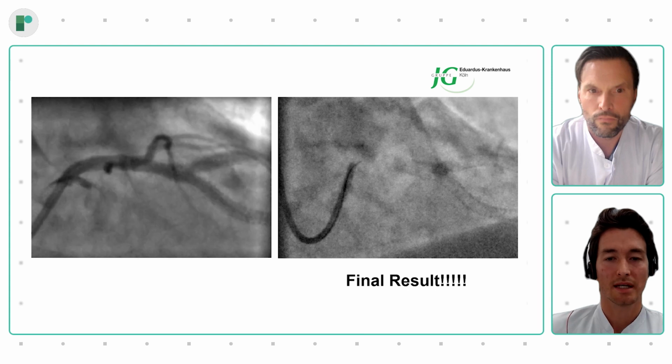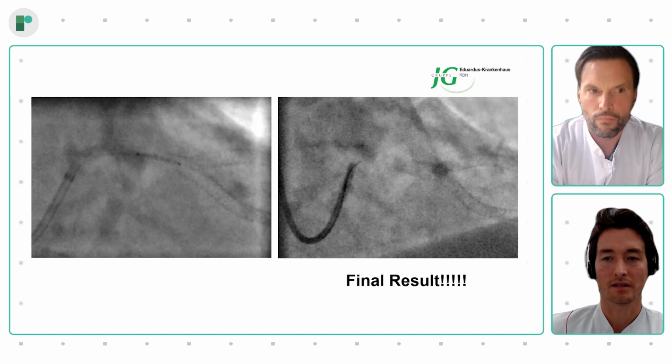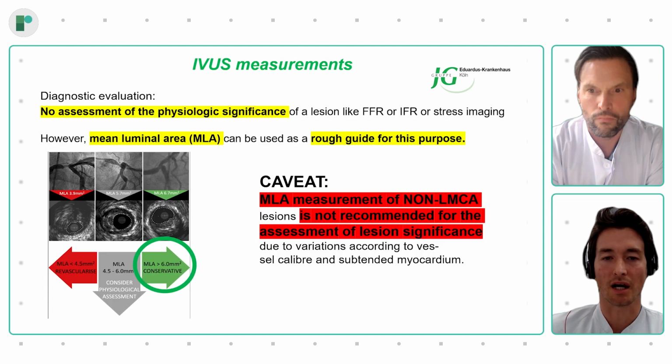And then we performed stenting and achieved a very nice angiographic and also HD IVUS result. I don't think we would have been able to really confidently do this without the use of HD IVUS.